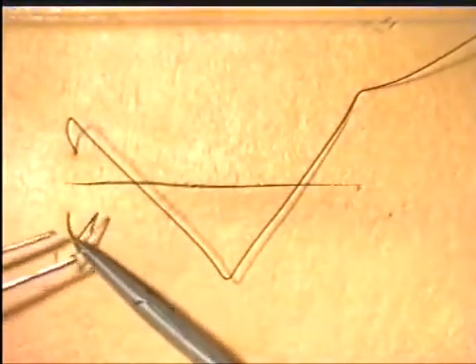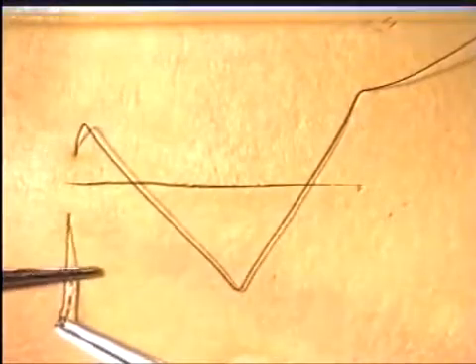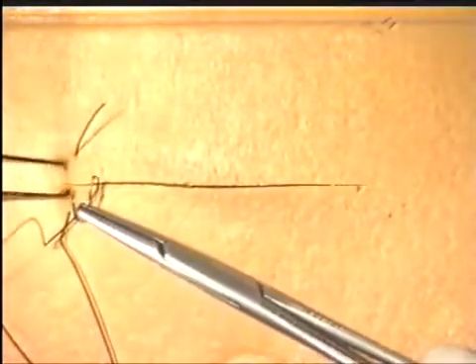The suture is put in as you see in the standard manner. The needle is reversed and then, taking just a small bite of the skin edges, the suture is completed and a reef knot tied.